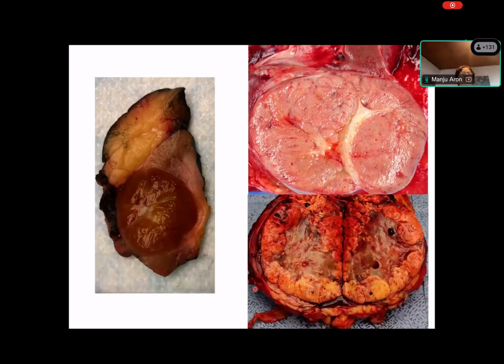Now, with respect to scarring and hyalinization, it's not very specific, but you kind of see it in certain areas. For example, in this oncocytoma, you can see kind of central scarring. This is a pale tumor, so this is actually a chromophobe RCC. Sometimes you can see central scarring even in this chromophobe RCC, but usually for a multiple choice question, if you have oncocytoma and chromophobe, you want to pick oncocytoma as the tumor which shows a central stellate scar, which is also seen on radiology and CT images.